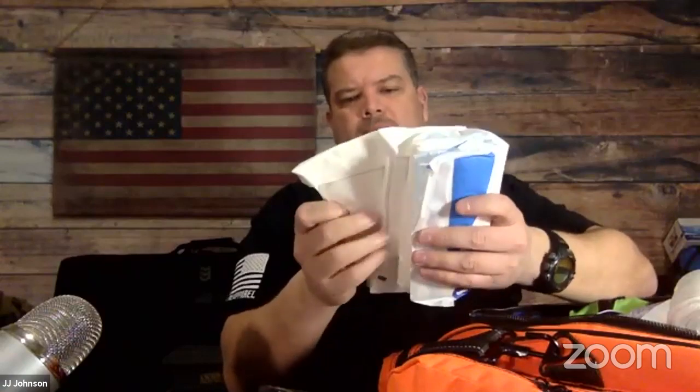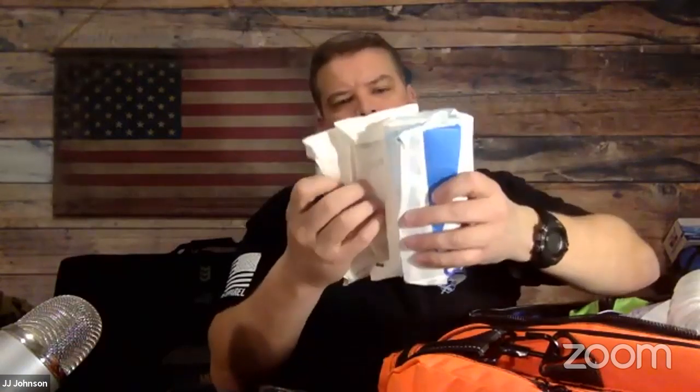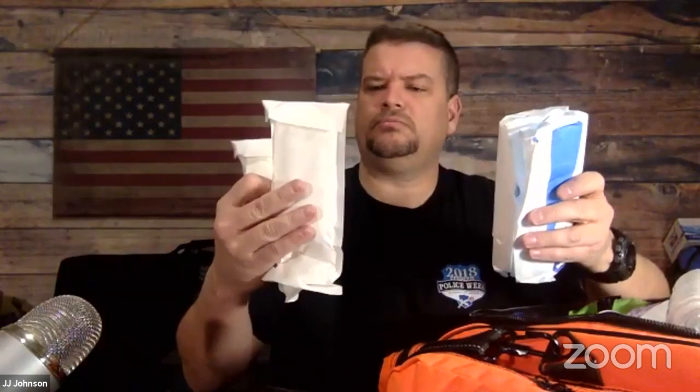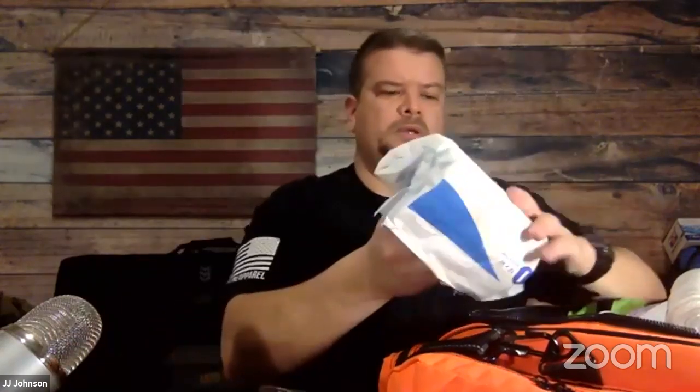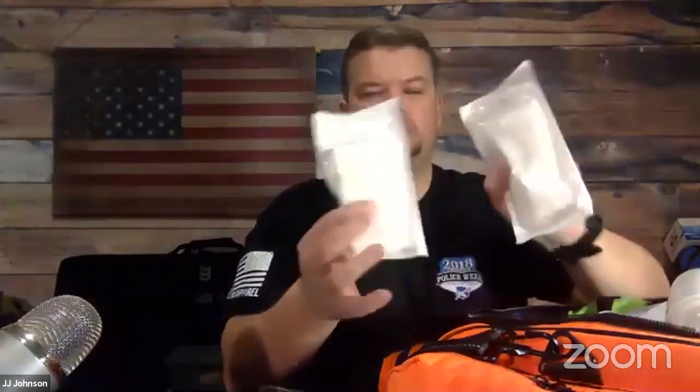So these are some ab pads. They can also double, apparently, as, I don't know, it says tampon, abdominal, that's weird. Anyway, ab pads. This is a large sterile dressing, a big one. And some more ab pads, a little smaller.